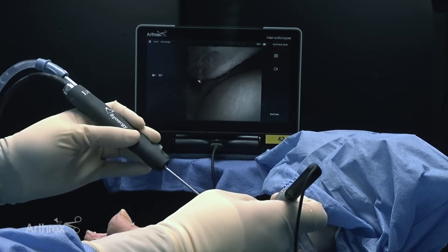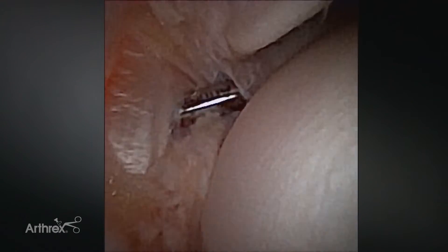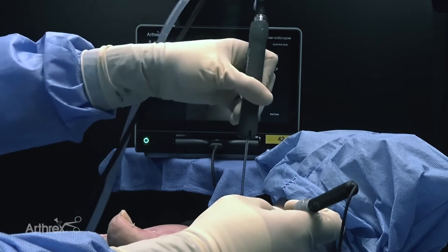I can sweep the Nano Sabre across the joint, piston it, and rotate it. The Nano Sabre is 2.8 millimeters, which allows me to move around the joint, see what I need to see, and take out the tissue I need to remove. I can open up the joint laterally, removing some of the scar tissue. The Nano Shaver handpiece allows me to choke up on the shaver and fine-tune my movements around the joint, as compared to traditional larger shaver handles.